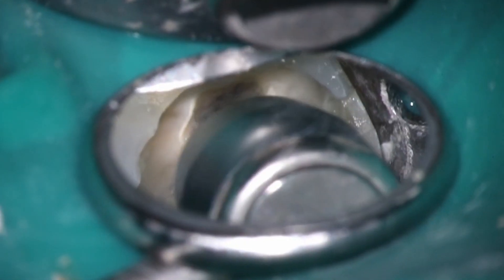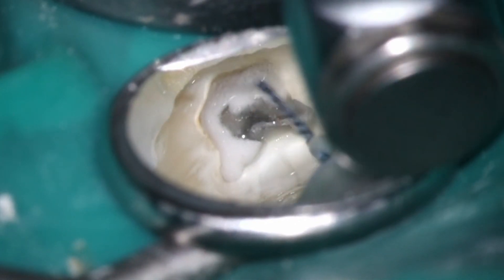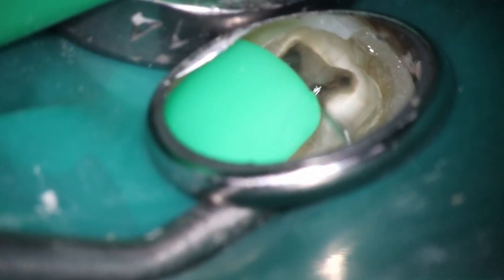You do see a little bit of a vertical line running through the tooth there. It's not actually a crack per se, because you can't really tell where it started. That's not anything to worry about as far as the tooth being unrestorable or anything like that. You can see a lot of bubbling activity in here. Going back in with the Triton like normal, just to get this thing rinsed out and as clean as possible.